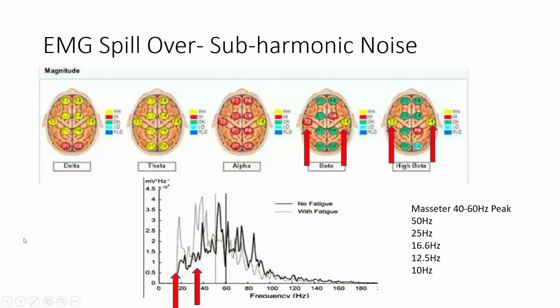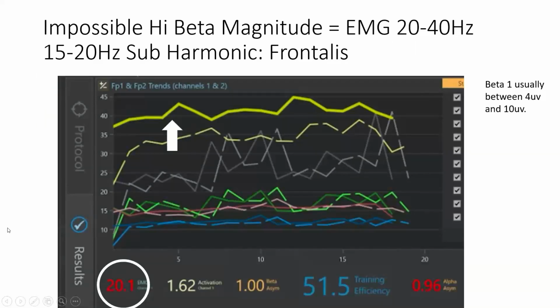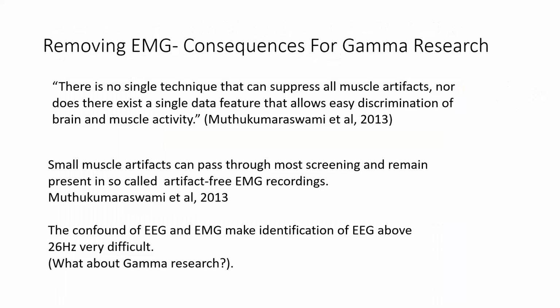Now these delta and thetas, they're not likely anything to do with this, especially at 2 and 3 standard deviations. The odds of them having anything to do with this are like 99.9999 to 1 that there would be any content here driving this. So we talked about this one already. Let's jump to removing EMG.